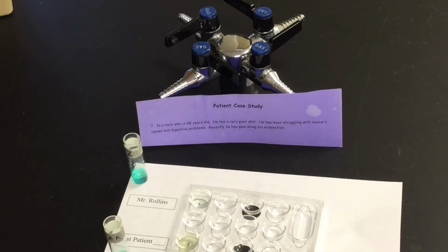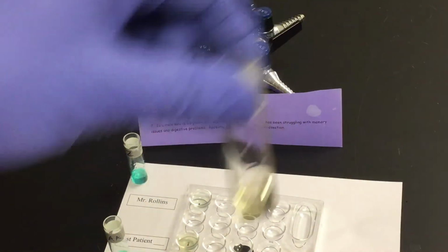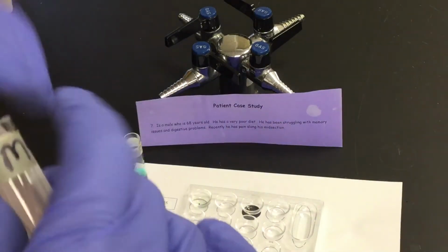we want to do is add it to the tube, and look at that particular sample. So I've taken the tube, I've added the urine to it, and there is my urine sample. I'm going to make it a little easier for you, put it up against white paper. This will help you get color and clarity.